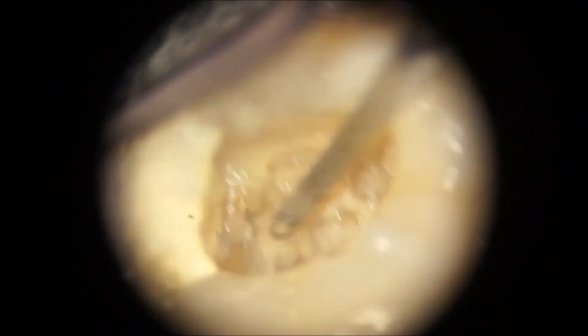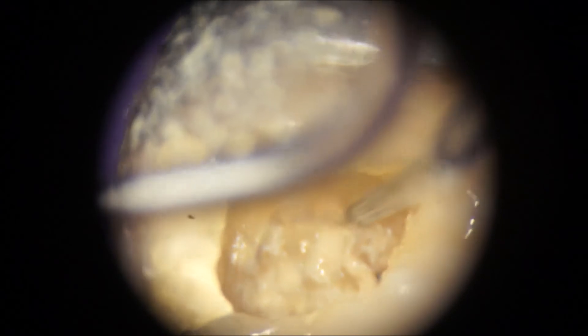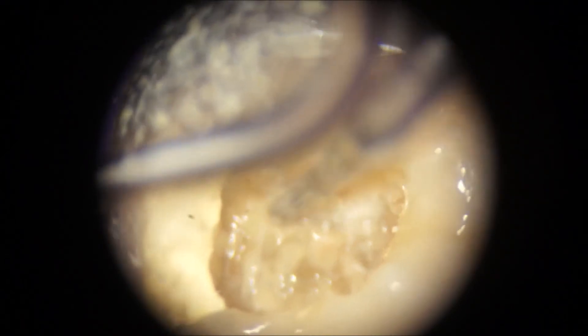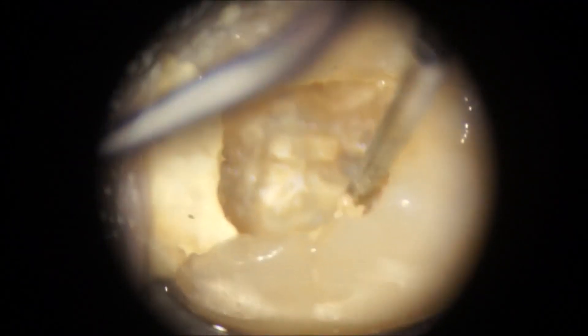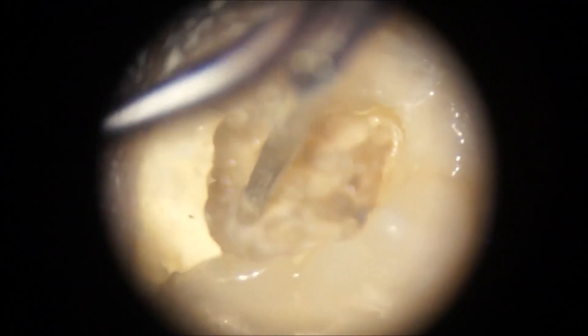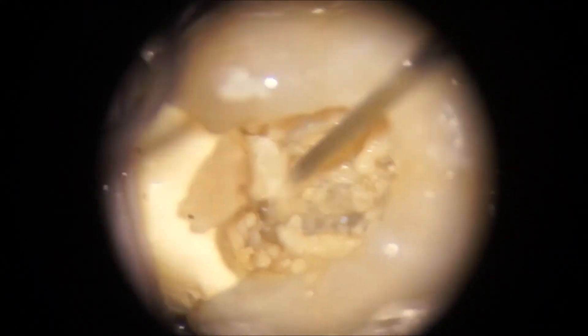Frequent wiping is needed to make sure we have a clear field of view. As you can see, it's starting to dislodge. In this case we were lucky — sometimes they don't dislodge. In fact, it became so loose that it simply disappeared into the high-volume suction unit when the assistant held the suction next to the tooth. It wasn't even necessary to lift it out with an excavating instrument.